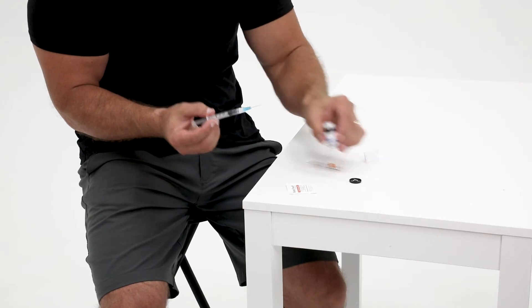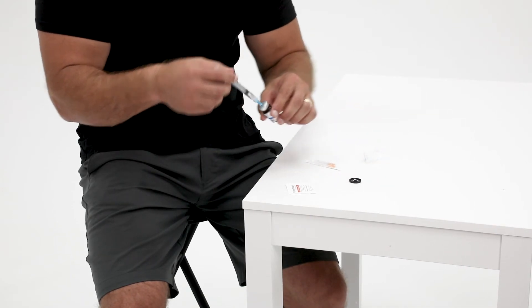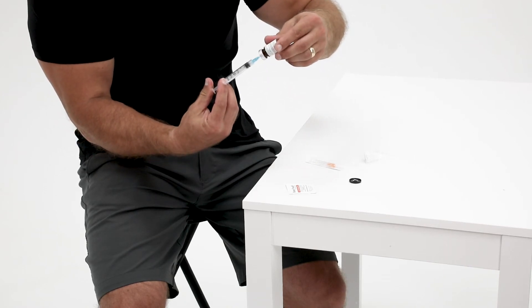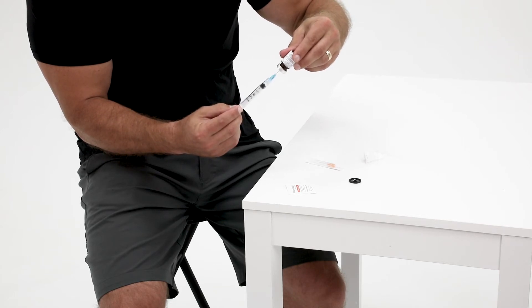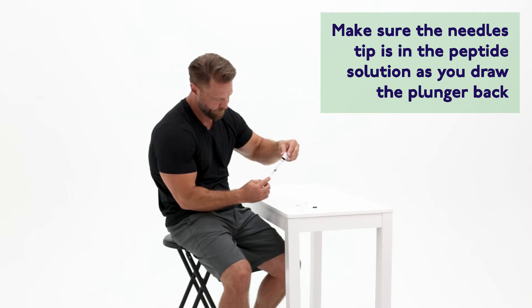Hold the barrel of the syringe as you insert the needle through the rubber stopper of the medication vial. Once the needle is inside, flip the vial upside down and push the plunger all the way to transfer the air from the syringe into the vial. Then pull back the plunger to transfer the prescribed amount of medication into the syringe.